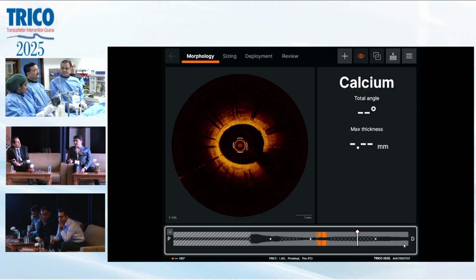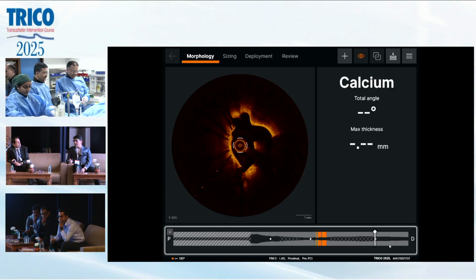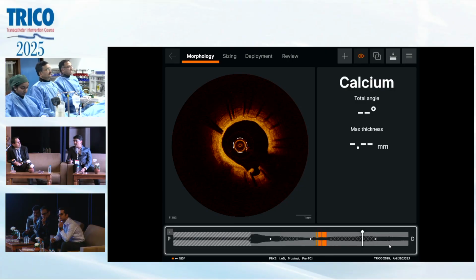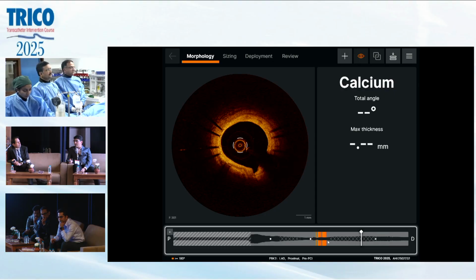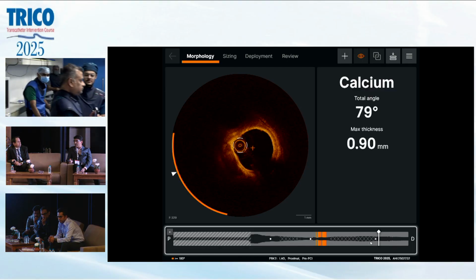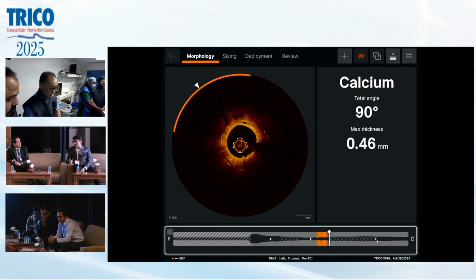Okay, so Doug, if you can give your opinion on OCT, let's have some discussion with the panel about it. Let me see this, that's the OCT, put it back. This one? Okay, good. So let's see who's right, who's wrong.